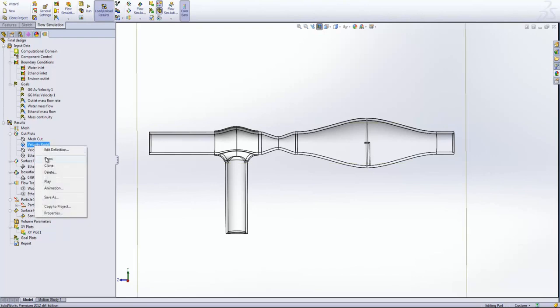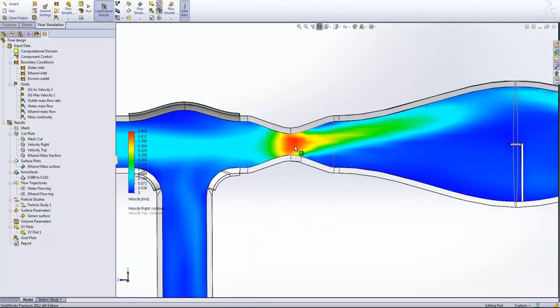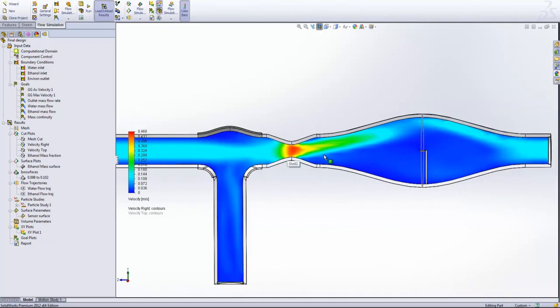First of all, have a look at our velocity. We'll see that we've still got this jet coming through here, and our peak velocity value has increased substantially because we're being accelerated up in this, I'm going to call it a nozzle region, but we do still have this slower region, so it's decelerated again in this area of the plot.